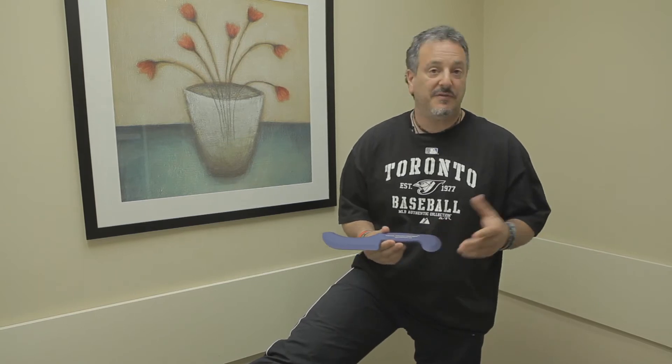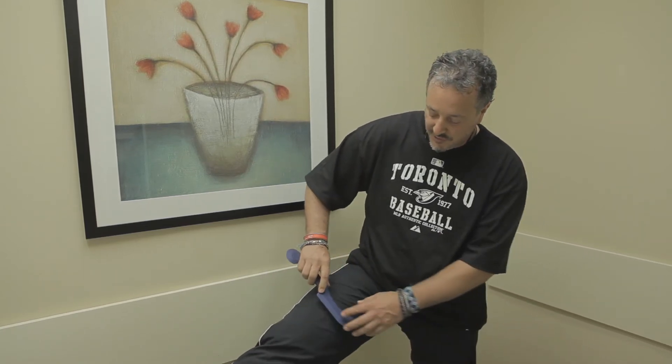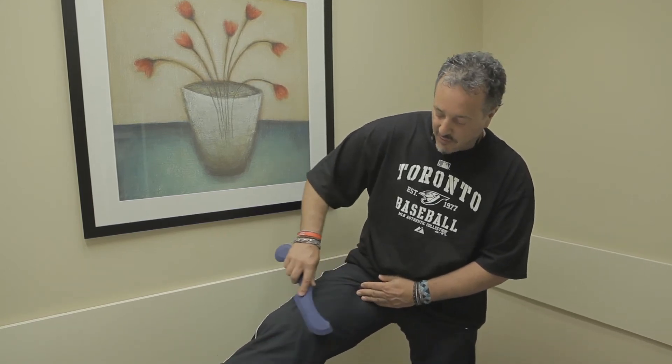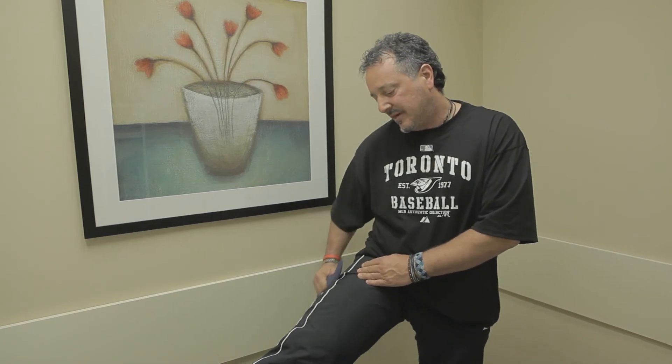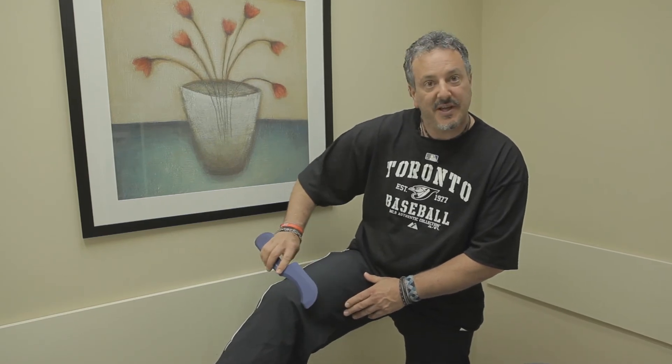The different treatment edges are for treating different body parts. If you want to work on a large muscle that's flatter, you can use this flat surface here and work on the inside of a thigh, the outside of a thigh, or the IT band. The half moon circle is really good for working around the VMO and the quadriceps, so you can cover more surface area that way.